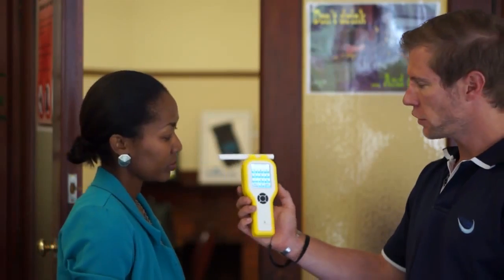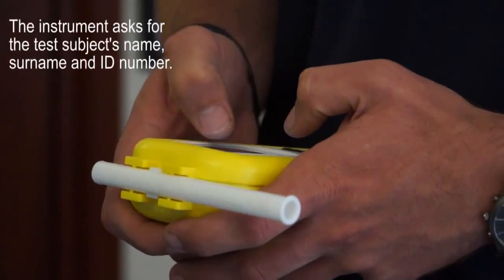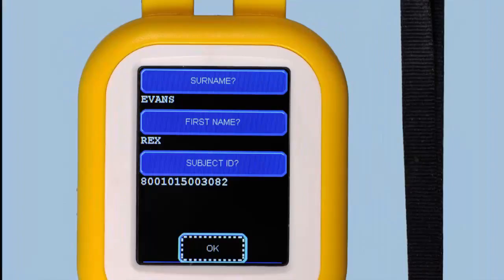Because we've got our data logging function on, it asks us now for the subject surname, so I'll put that in and say enter. Now it asks for the ID number as well. Once the ID number is in, we say okay, and it brings up a summary of what we've put in.